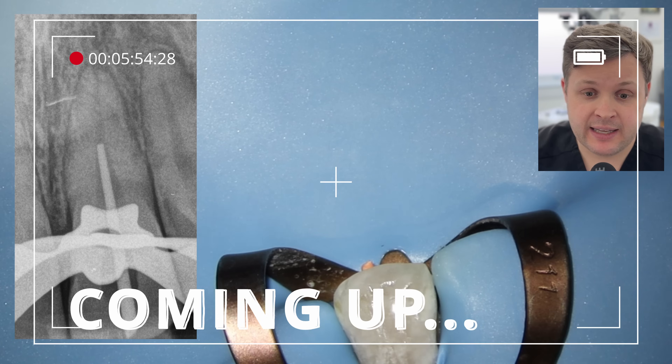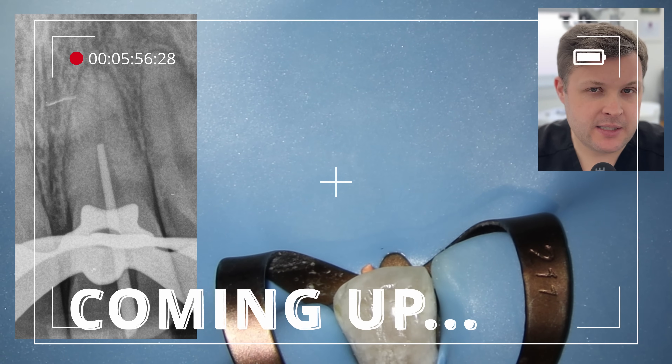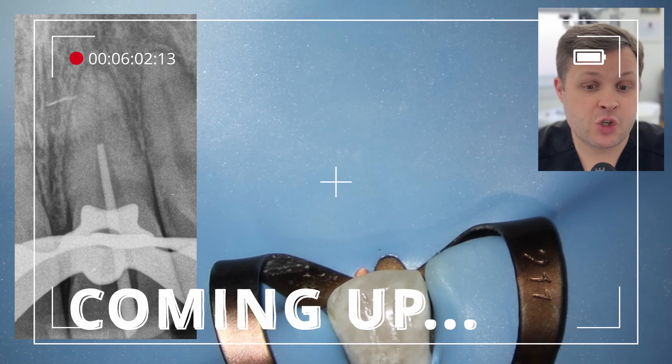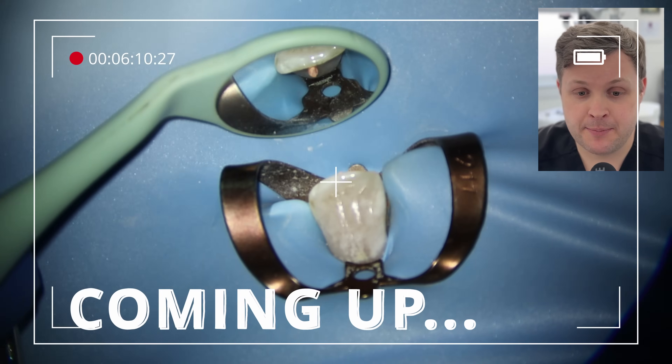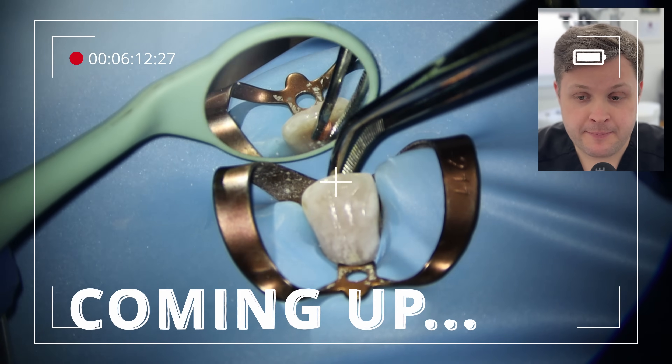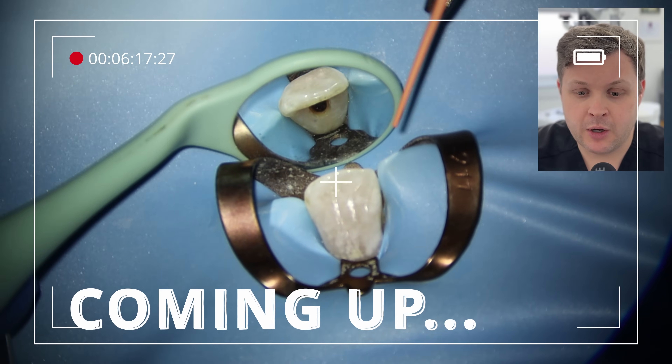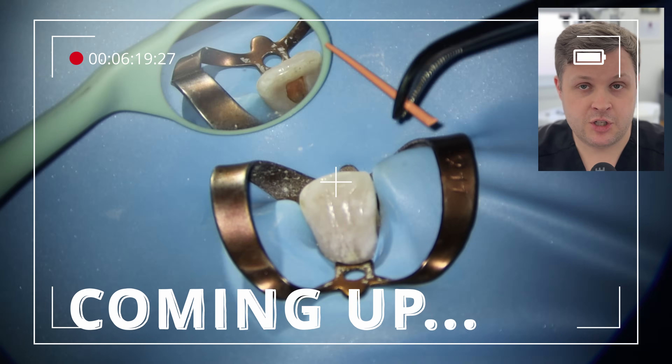We look at the x-ray here and maybe if we squint our eyes, we can see there's maybe a bit of a crack. But this also could be the superimposition of the tip of the nose or even the lip. I've decided not to take a cone beam CT scan in this case, but I'm going to do a working length check.